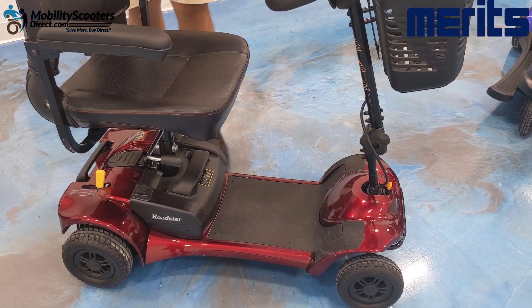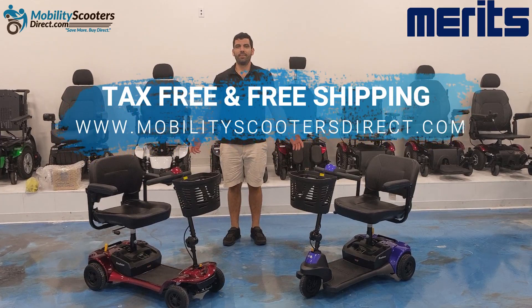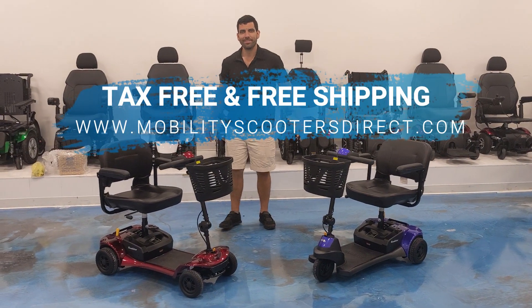One thing to keep in mind when you first receive your Roadster mobility scooter is that the batteries need to be charged overnight. We offer this scooter tax-free and with free shipping at MobilityScootersDirect.com.